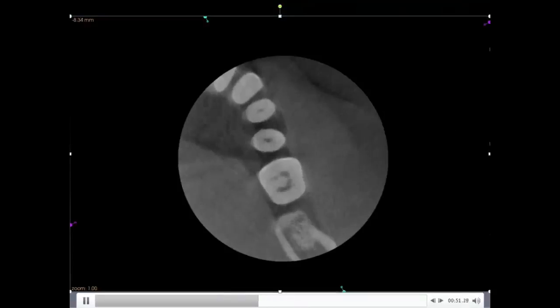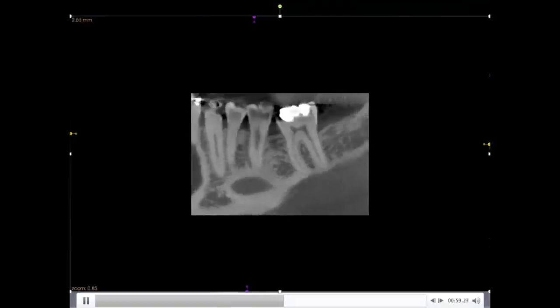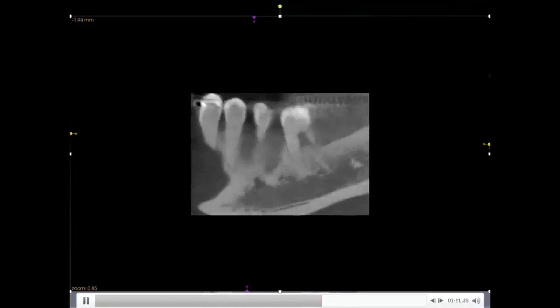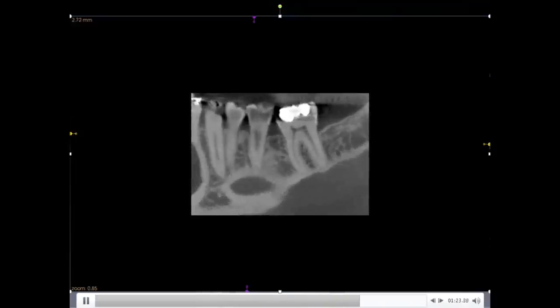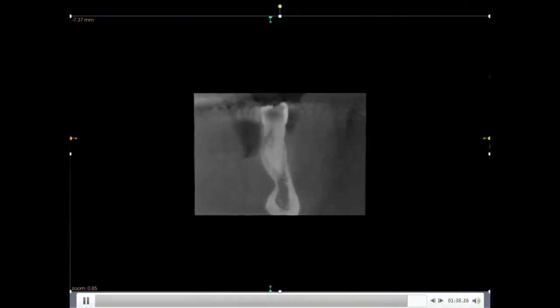We notice that our ligament does appear intact coronally, which is why we don't have any probing — and that's going to be important for how we address this. Going to our sagittal view, it doesn't show us too much beyond what we can see radiographically, but we can note that the mental nerve is in close approximation to the apex of this tooth, and there is a strong curvature in the apical third as well — something to note if we're going to attempt this endodontically. The coronal view gives us a good indication of whether we're going to try to tackle this surgically versus non-surgically. We can see that although it's a thin shelf, the crest of bone is intact at the area where it is perforating, and it's not communicating with the sulcus at all.